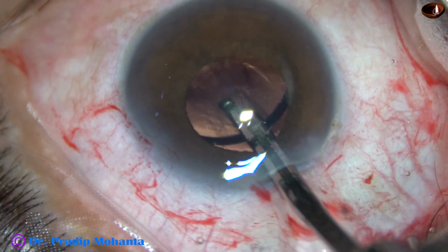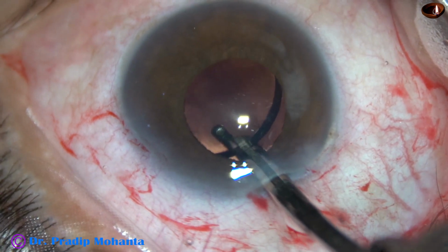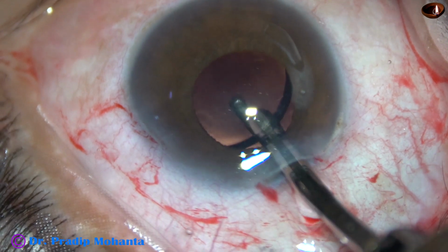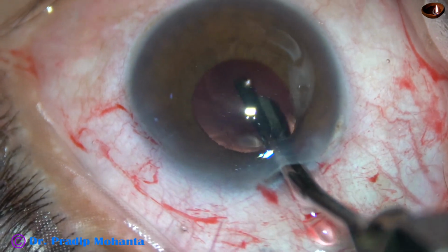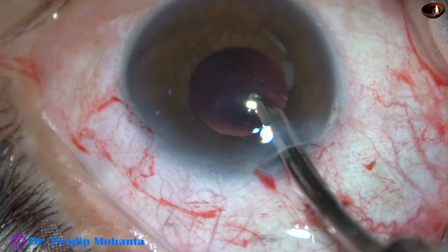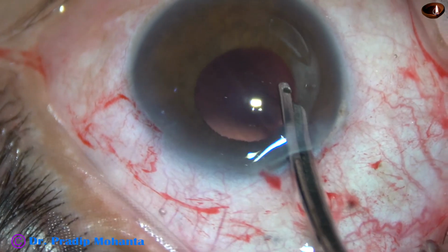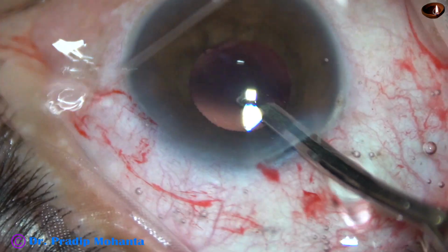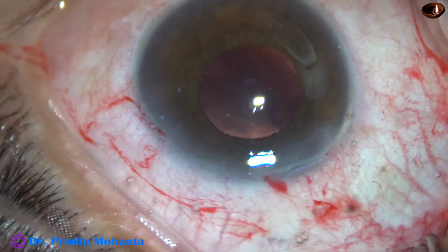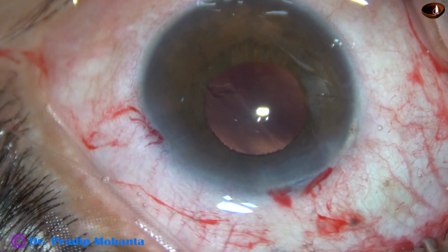I go behind the intraocular lens. See, the edge of the lens is so thick. The edge is thick and the central part is thin. This is a concave lens, minus 4 diopter. A concave lens is being placed in the capsular bag because the eye is highly myopic, 31 millimeter is the axial length.